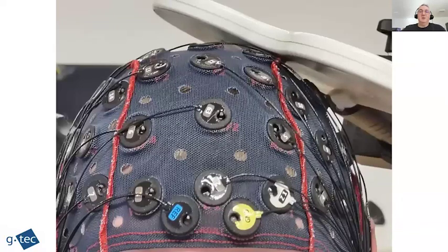So we shall see today in 10 minutes. I'm supposed to prepare Christoph, who will be my subject today, for the recording. And on the opposite side, because it does have this electrical circuit inside, it actually has the larger pulse artifact. So with our passive electrodes, we get the pulse artifact around 1.5 milliseconds. It's very short. And with these electrodes, we get a 7 to 10 millisecond delay artifact.